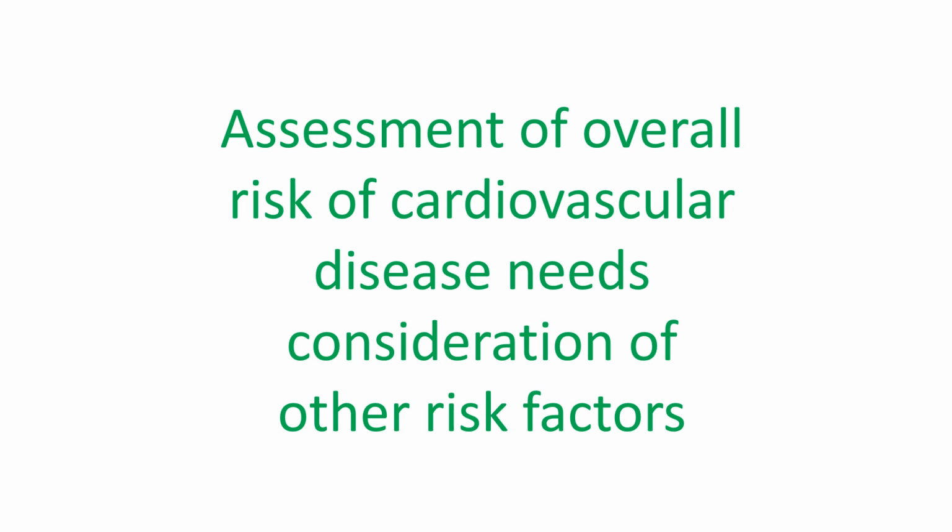The total amount of calcium in the major coronary branches is calculated and is given as an Agatston score. A 0 score would mean that there are no calcium deposits in the coronary arteries and low risk of myocardial infarction in the near future. Higher the score, higher the risk. A score of 100 to 300 indicates moderate amount of calcium in the plaques and carries somewhat high risk of myocardial infarction, while a score more than 300 carries a very high risk.